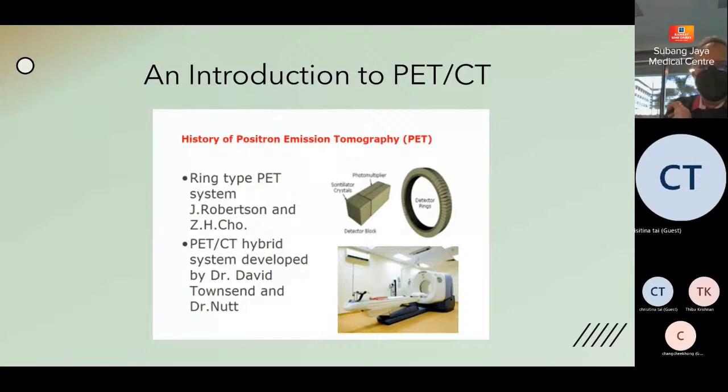We're not giving it a funeral yet because it's still functioning. But from May this year, there won't be any more support for it. And as far as I know, the old PET CT that we have is the oldest functioning 64 slice PET CT in the world. Most PET CTs are closed down after 5 to 10 years, but we've kept it going for nearly 14 years.